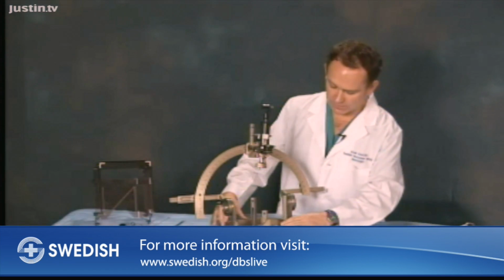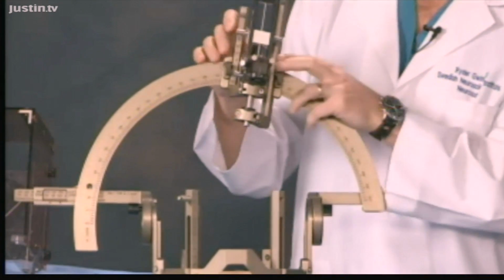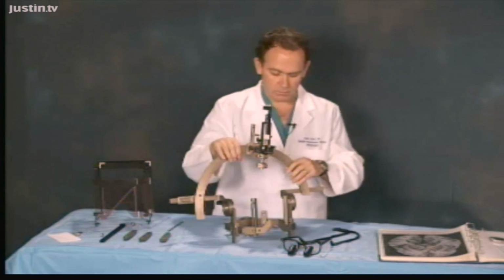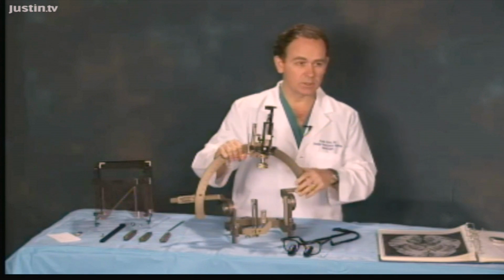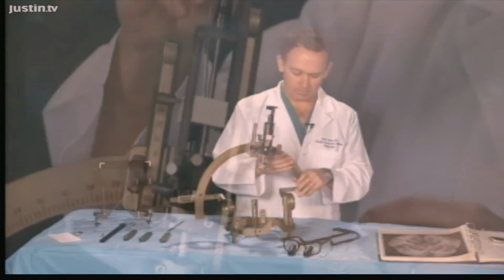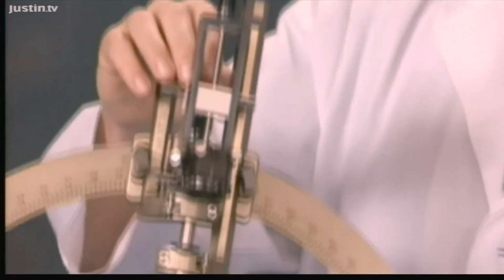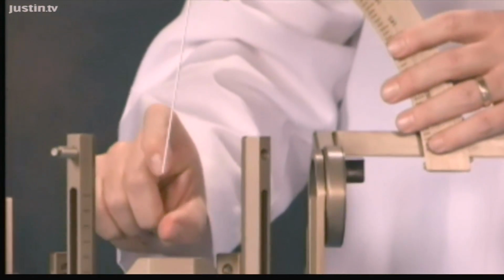This is the initial frame that was placed. We can either change this arc amount, or we can also change this, which is called the ring measurement here. And so we can move in these two dimensions with this arc without actually altering our eventual target at all. This cannula then goes down through the microdrive and enters, and it stops a little bit above our target.